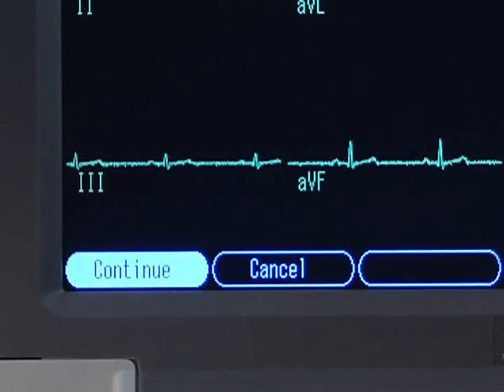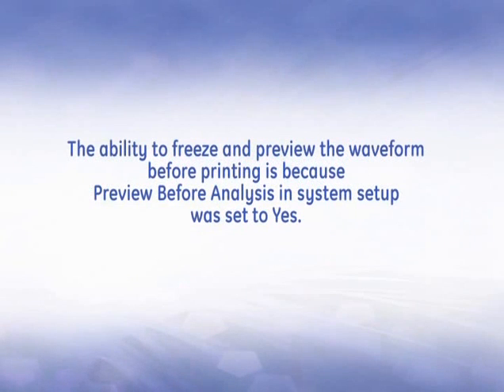If you want to return to acquiring a new ECG and start again, press Cancel. The ability to freeze the screen and preview the waveform before printing is because Preview before analysis in system setup was set to Yes. Refer to your operator's manual or the clinical reference guide for a more in-depth explanation.